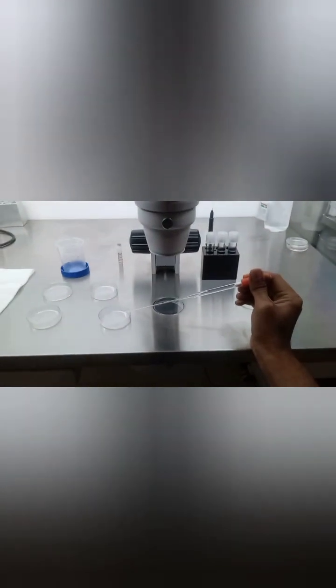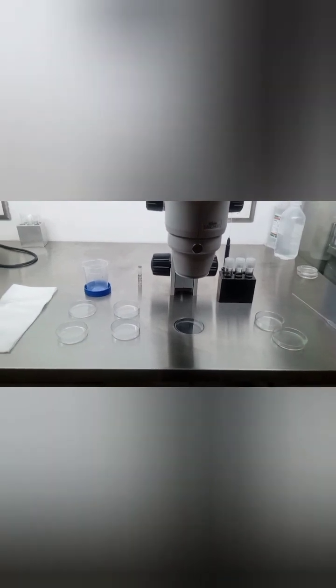As the OPU begins, I screen the follicular fluid and transfer the obtained OCCs from the follicular fluid to the flushing media using a glass Pasteur pipette. The excess follicular fluid is poured back into the container, wiped using a tissue, and kept back for filling more follicular fluid. And this continues until the OPU is over.